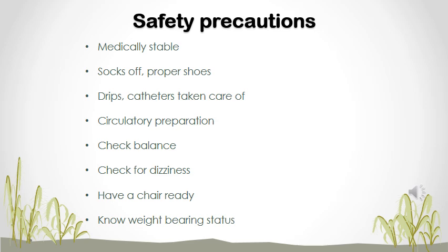Circulatory prep. So you're going to ask your patient to move their feet, do some foot pumps, move their limbs, get the blood flowing, after which you will check their balance. You're going to test their balance. Ask them if they are dizzy, and you can repeat this a few times throughout walking with them.